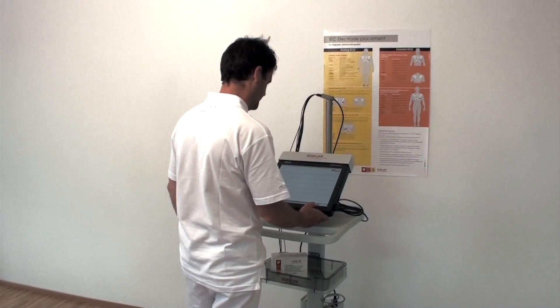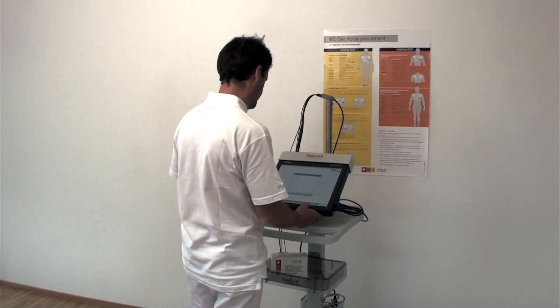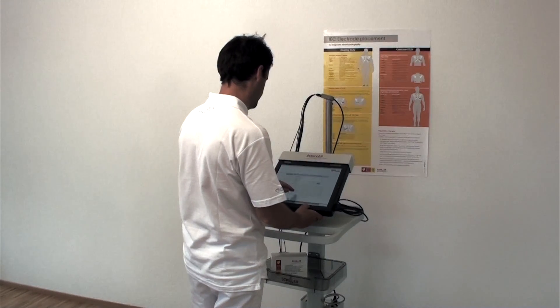In this instruction, we show you how to apply reusable suction electrodes for one of our resting ECGs, the MS 2015, in order to ensure a good electrical signal for successful recording.